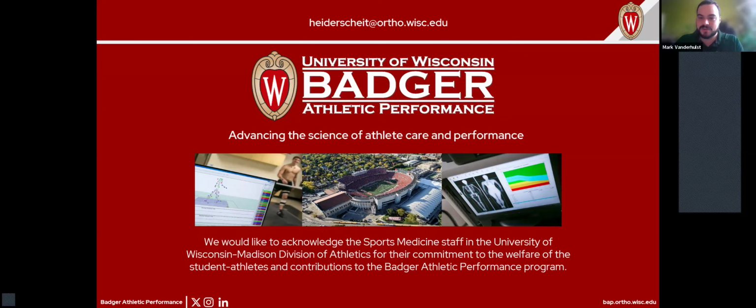Excellent. We have a couple of questions here that I think are related. Do you use this information to help guide an expected return to play for athletes? And can we discuss a little bit how we correlate the information we attained from the exam with treatment options, and how that varies from prior non-ultrasound recommendations?